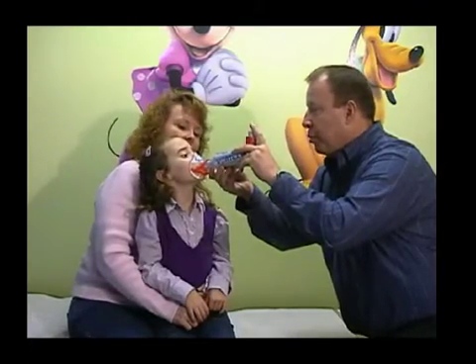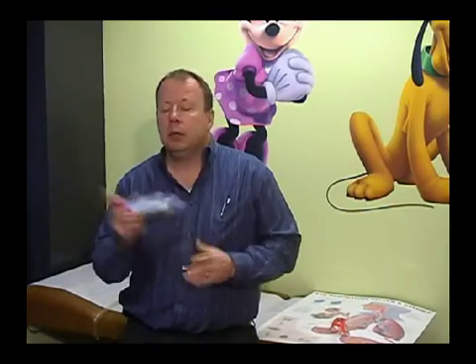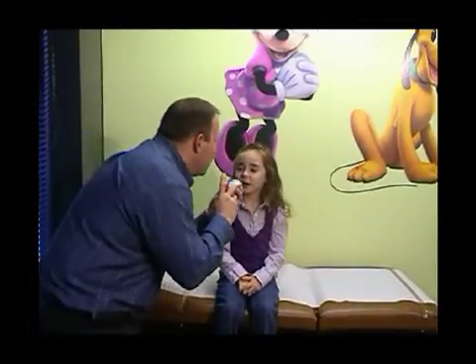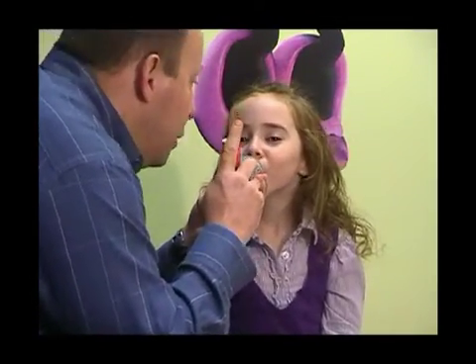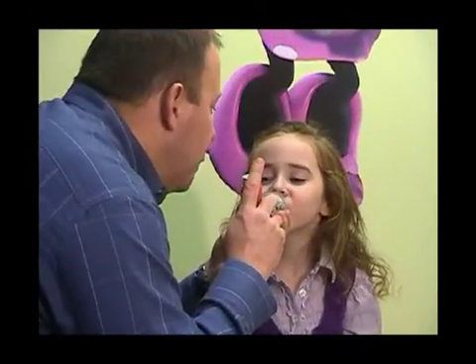But in some children who are older and can cooperate but not do the whole technique, you can do your shake and just have them put their mouth on here, puff it, have them take 6 or 8 breaths, and that in itself would get the medicine where it needs to go. If you can start trying to have them take a few deeper breaths, maybe even holding it for a little bit longer, that would get the medicine in even better.